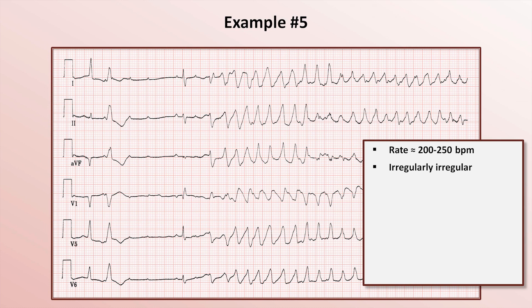It's irregularly irregular and the QRS complexes are wide. We could stop right there since we already have a probable diagnosis, but for instructive purposes let's see if we can identify any atrial activity.